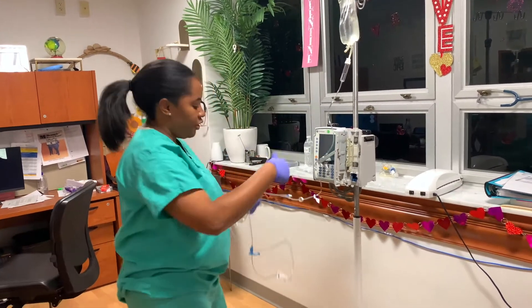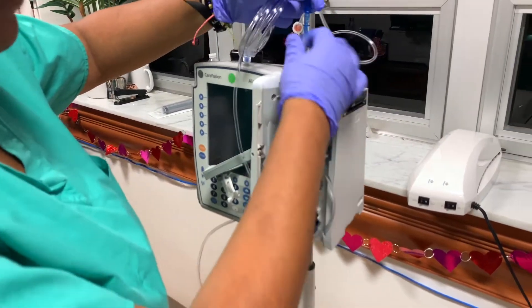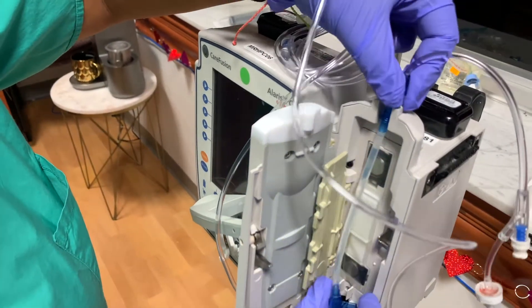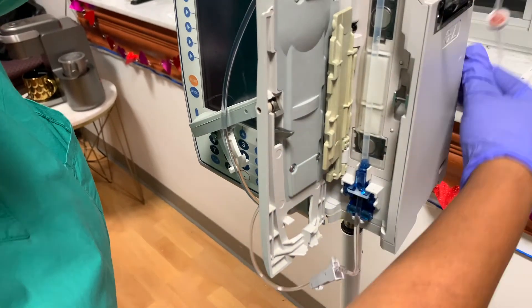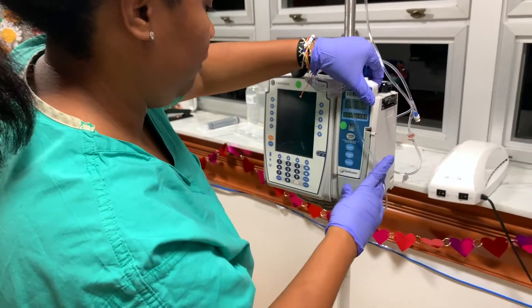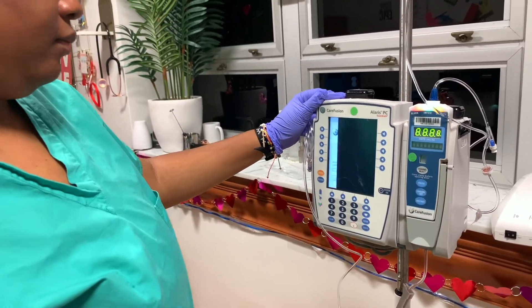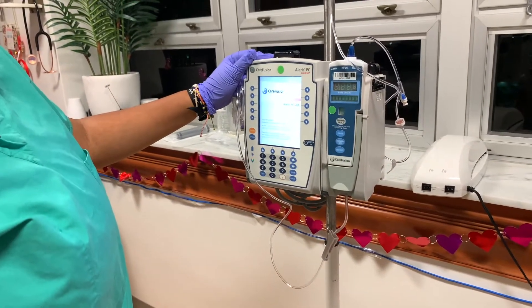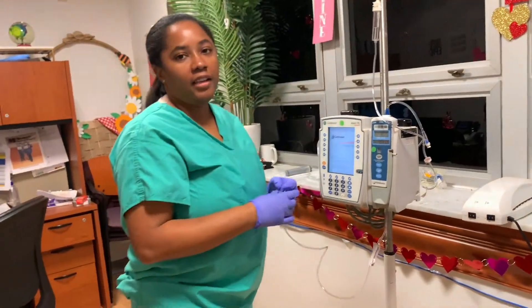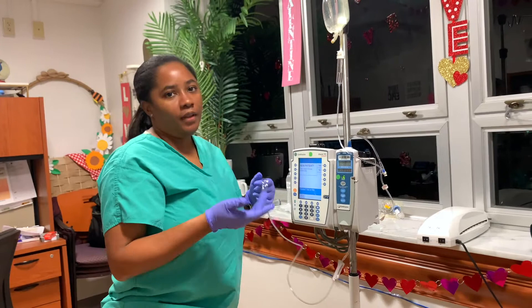So after we prime, we check to make sure there's not a lot of air bubbles — everything looks good — because air bubbles can cause air embolism, and we don't want that. So what we're going to do is, if you have the Alaris CareFusion, you do have that little blue area which is going to go inside of the hole and clip into the pump chamber. Snap it in and close the chamber. Once that's in place, go ahead and open it. We're able to make sure that we are scanning our medication and that it is going into the patient. We try not to manually program the pump as much as possible.